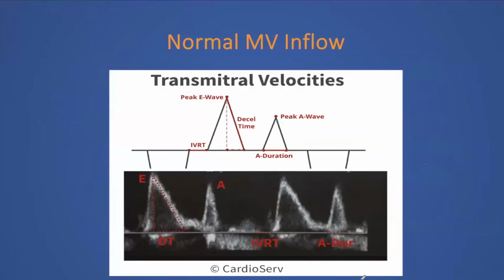Where do we pulse? At the tips. Do we pulse at the annulus of the mitral? Kathy? When do we pulse at the annulus? Oh, if you want to calculate the stroke volume of the mitral. Yes. We use it sometimes to calculate.